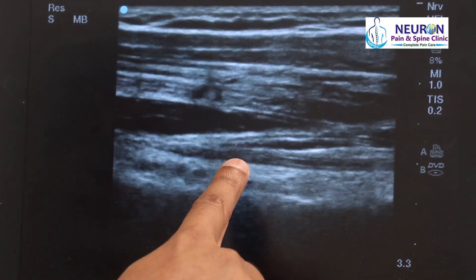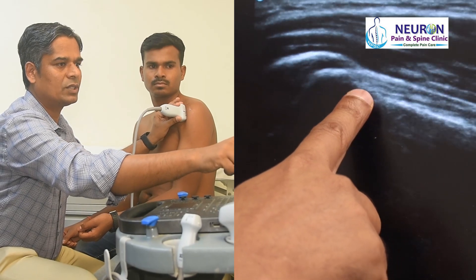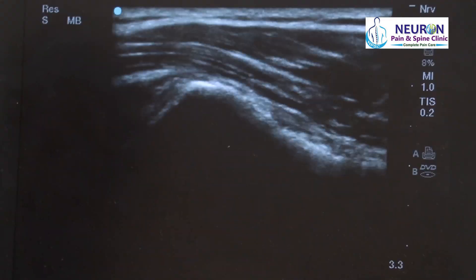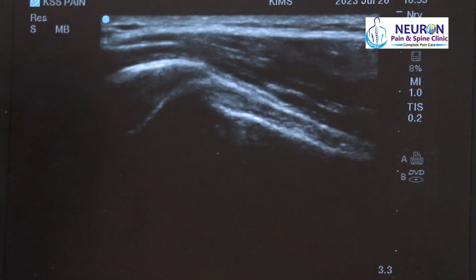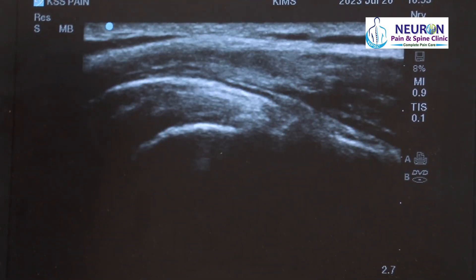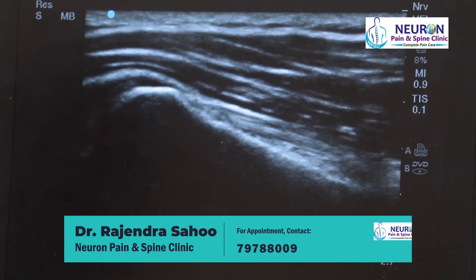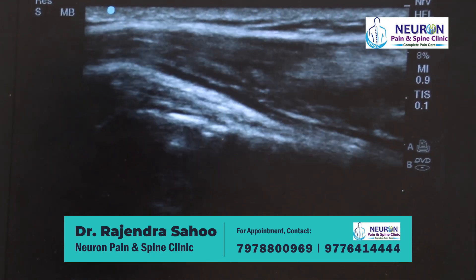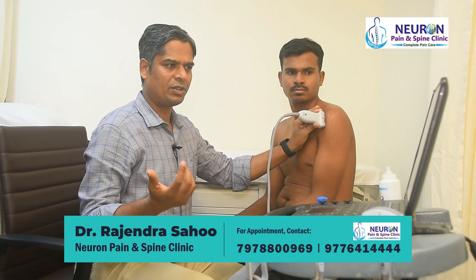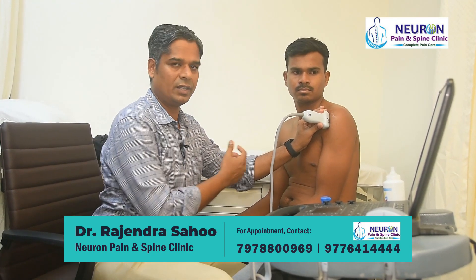That is the biceps tendon — there is no fluid. As I slowly go up, it goes inside the joint and becomes intra-articular. Here is the intra-articular portion of the biceps tendon with a fibrillar appearance. I scan the entirety of the tendon medially and laterally to look for any tendon fiber tear, tendinosis, or fluid. Steps one and two are done.